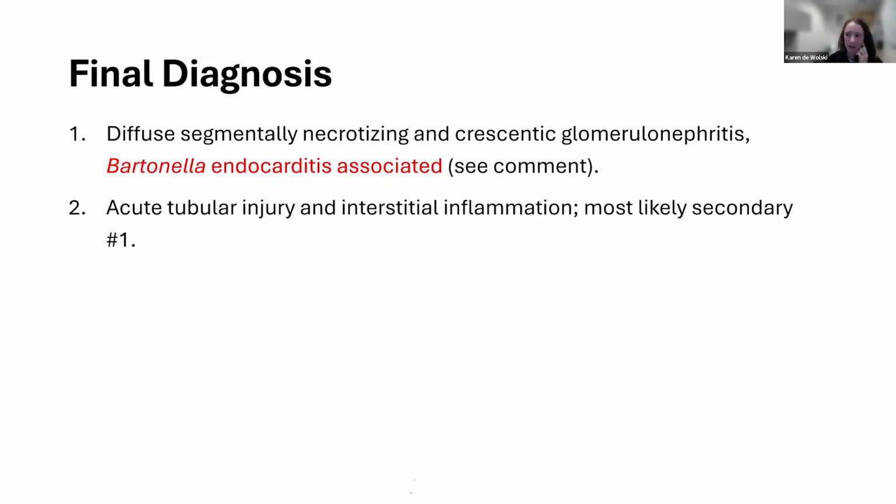I'll also just say on the follow-up, his skin biopsy had some final immunostaining that was done much later. I think he'd been discharged by then, but it was negative, because I see Henoch-Schönlein purpura, HSP, which I think was a really reasonable differential. It was negative for IgA and was actually pretty much negative for all staining except some C3. So they thought it looked like a leukocytoclastic vasculitis in the skin, but was not really consistent with a systemic vasculitis.